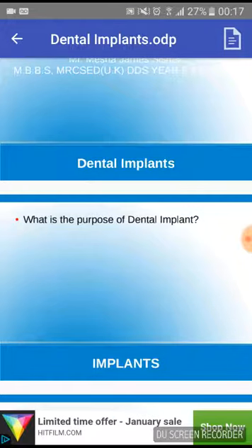Another property that a material that is used for implants should have is that it should be biocompatible. Also, it should become osseointegrated, meaning that it is able to form new bone and become incorporated into the surrounding bone. So it must be resistant. It also must be resistant to occlusal and mechanical loads in the oral cavity itself.